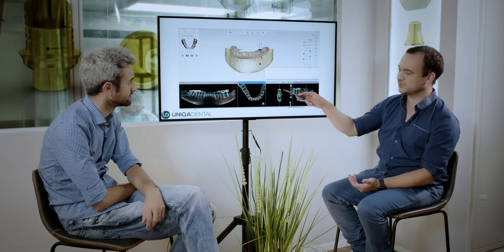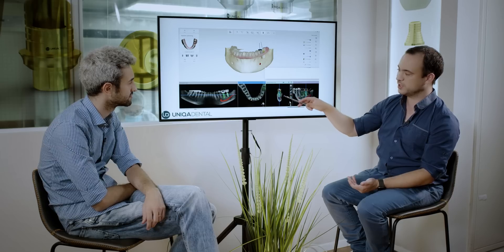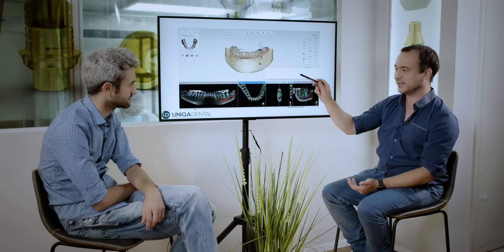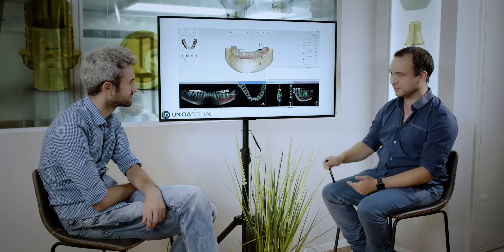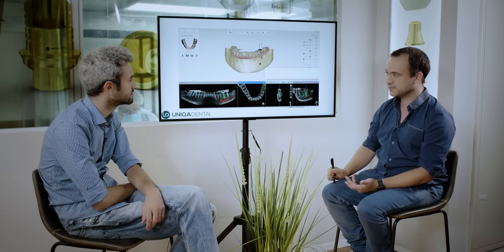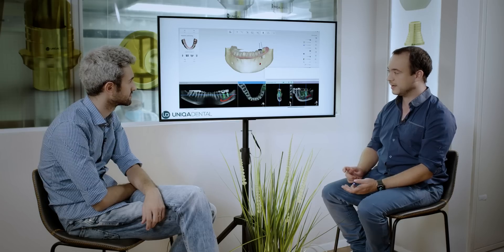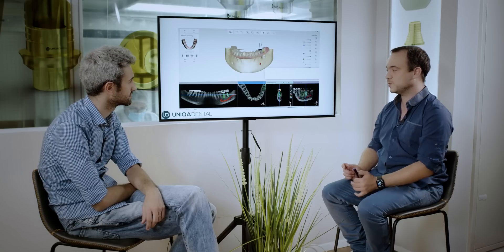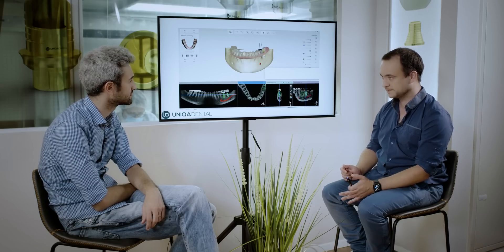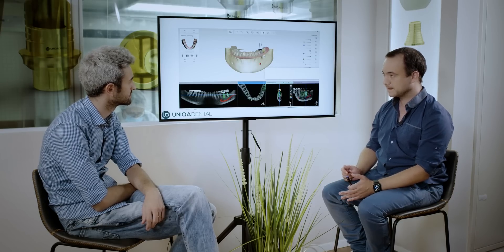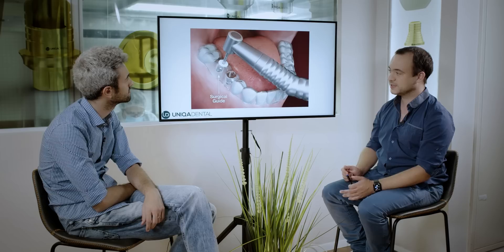So in here we can choose the implants. We know we have a safe space between the implant and the nerve and our anatomical structures. Everything is done according to the crowns we designed before — the crowns that we know where they should be — and this way the implant will be positioned perfectly according to those crowns.